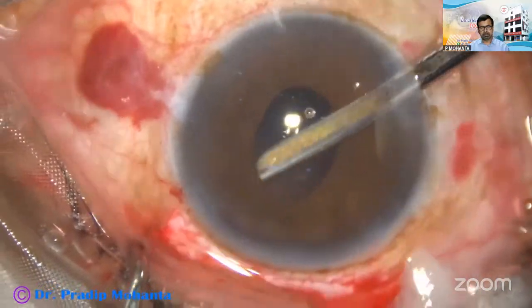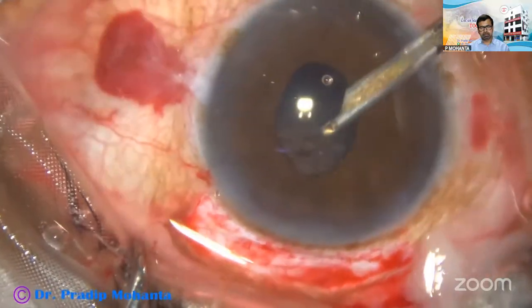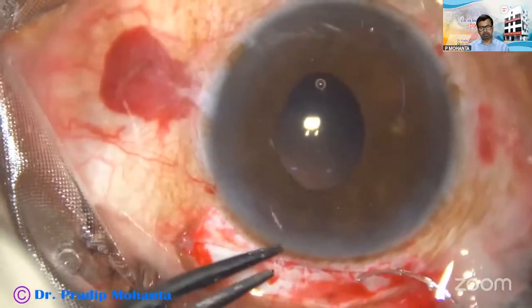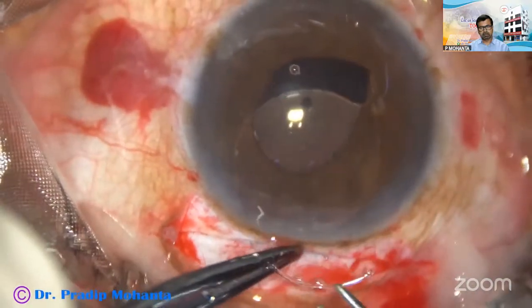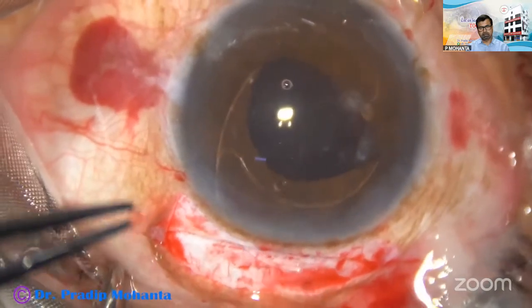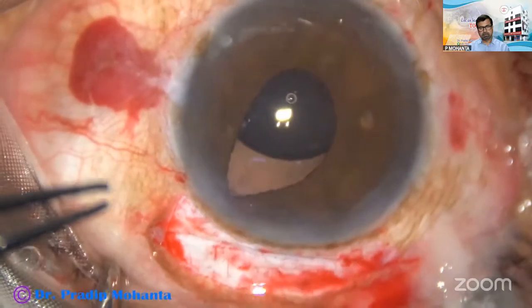In this case, I took a PMMA lens and placed it in the sulcus. This is a 6 millimeter PMMA lens, and the lens goes in the sulcus.